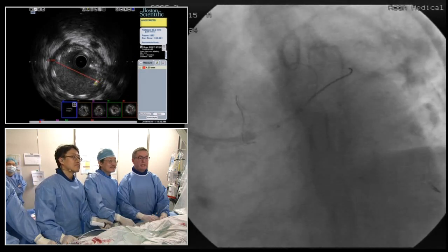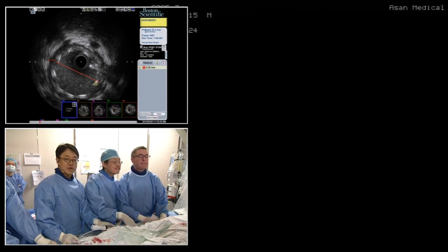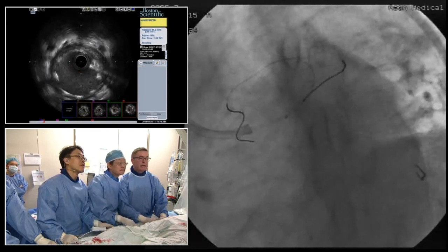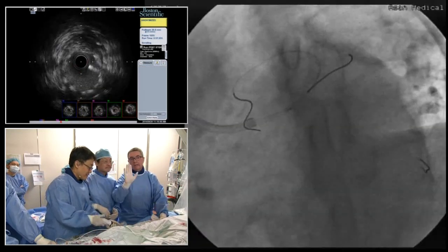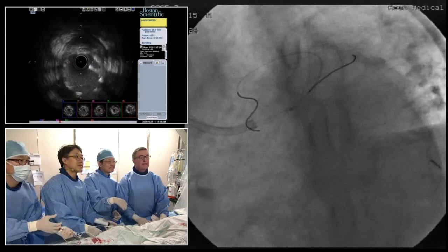Just gently in. Okay, you want to try sitting in? Yep. Try sitting in, just because we can see contrast though. Just in here. Okay, perfect. Wait a minute, I'll come back and get the marker there. Okay, beautiful. All right. Now, hang on. Just do a little test for me.